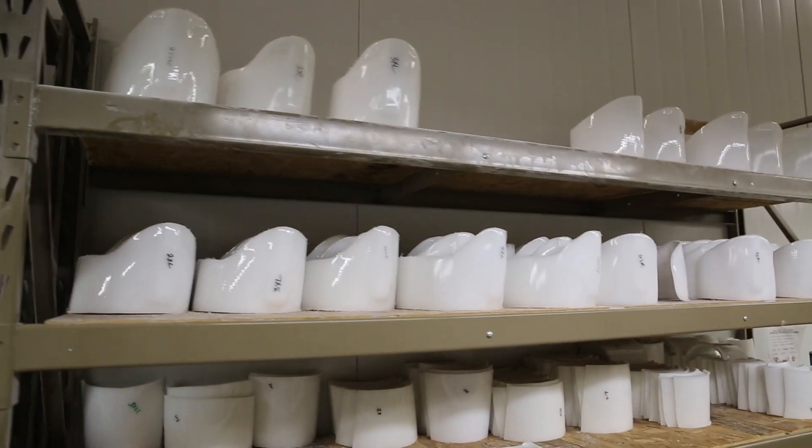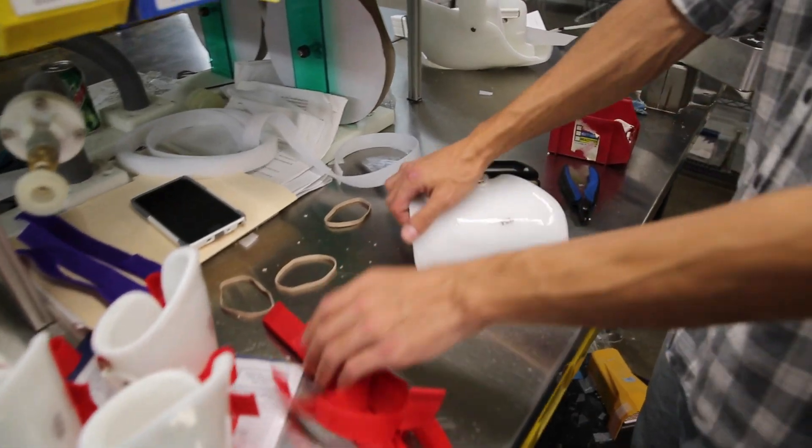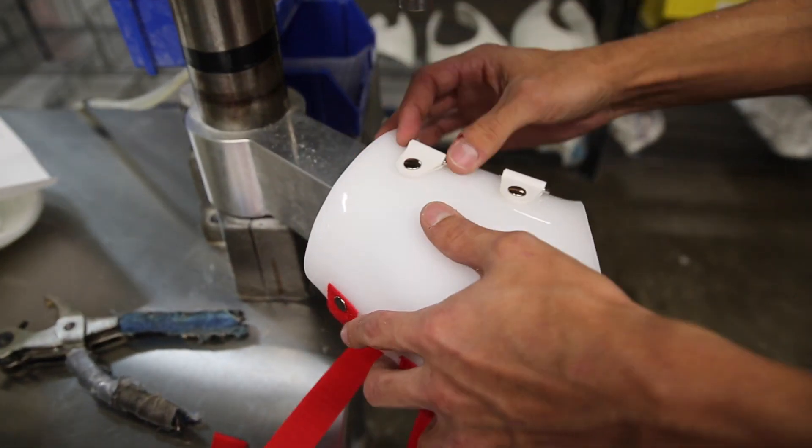So if you have a stiff elbow, or have surgery or an injury to your elbow, you have a device that you put on your elbow and it would stretch your elbow. So it's a rehabilitation device as opposed to a support arm.